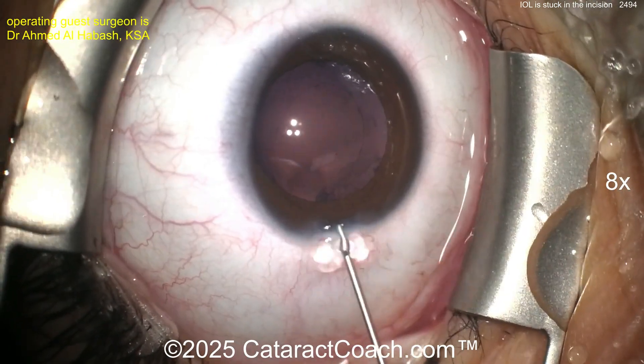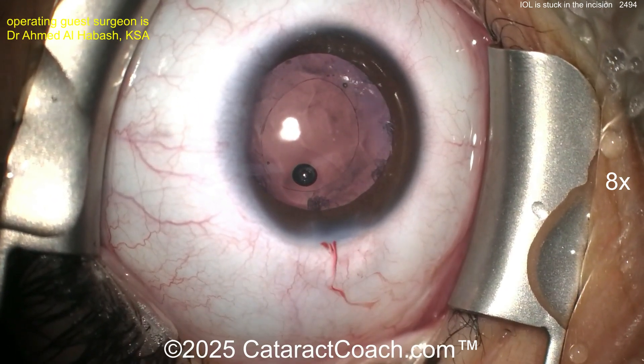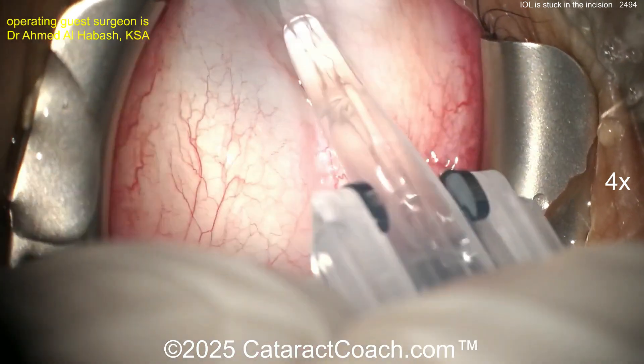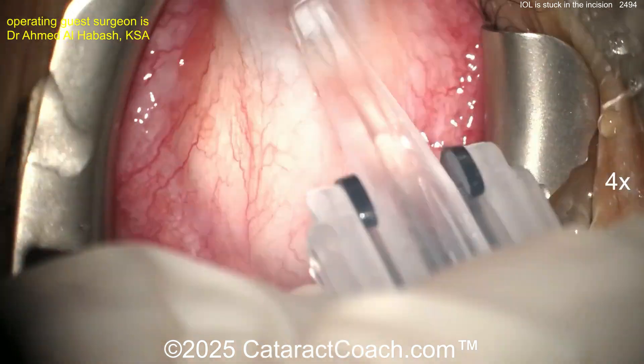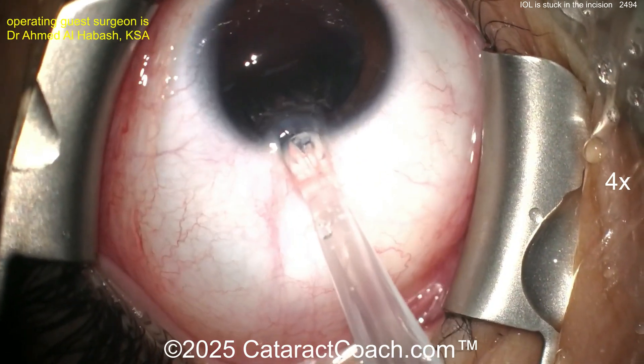At the end it looks pretty good — there's the viscoelastic filling up the capsular bag. Good-looking rhexis, I like this case. Should be an easy case finishing up right now. But oh my goodness, look what happened. Now you really want to enlarge the incision here — don't shove the eye over to the nasal canthus.